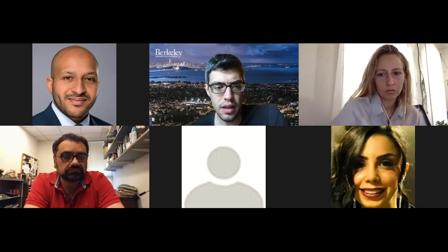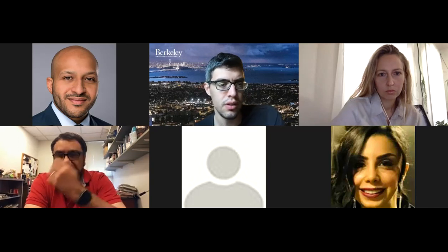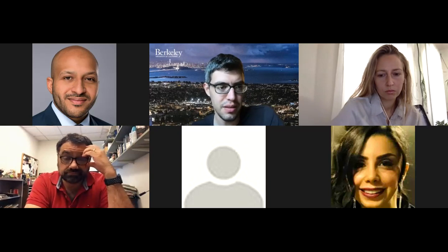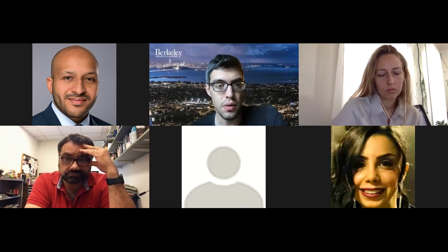I want to mention that please feel free to ask. I know this is probably a lot of information being thrown at you. These are new tools. This is almost a new field. But what's exciting is that there's a lot of information here in your bold fMRI data, and I think it's going to be super interesting for you to extract it using those tools. Feel free to contact us if you have any specific questions.